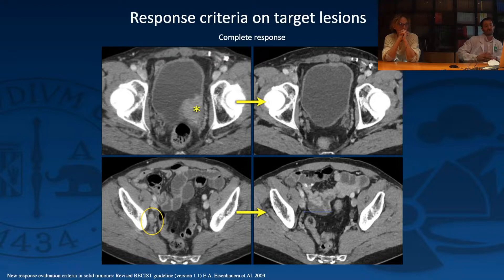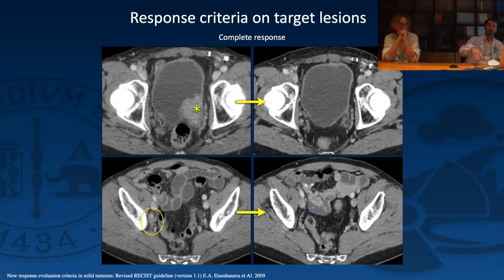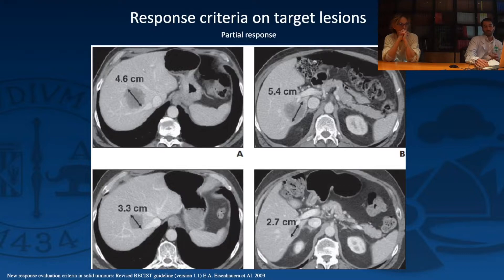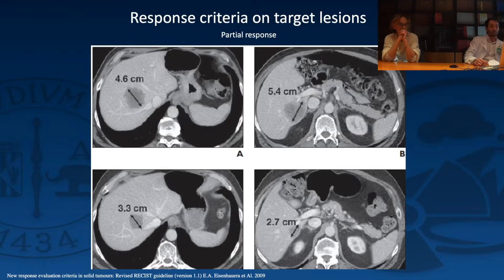For example, a bladder carcinoma that totally disappeared after the first follow-up represents complete response. Similarly, a lymph node in the obturator region that disappeared at follow-up is also complete response. In a partial response example, two liver lesions measured 4.6 and 5.4 cm — a total of 10 cm. At the next follow-up, the combined measurement decreased to about 6 cm, a 40% decrease — this is partial response.